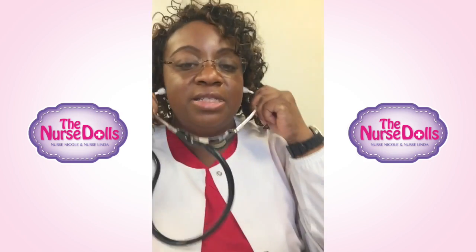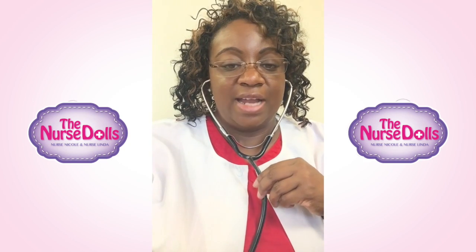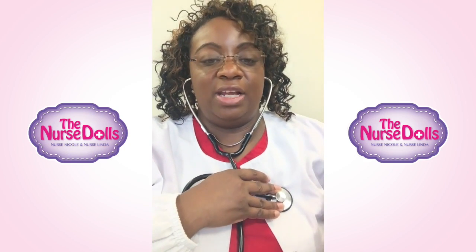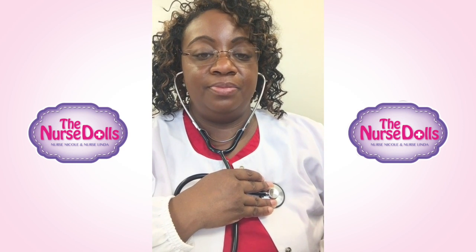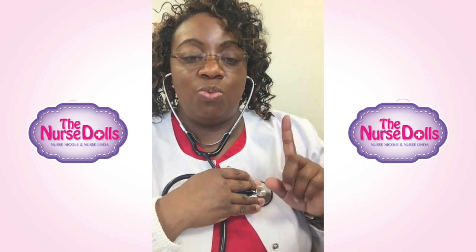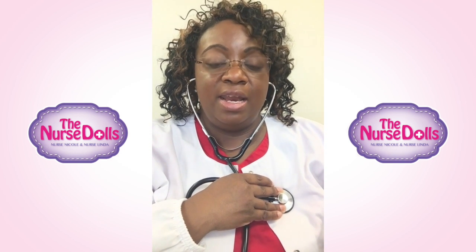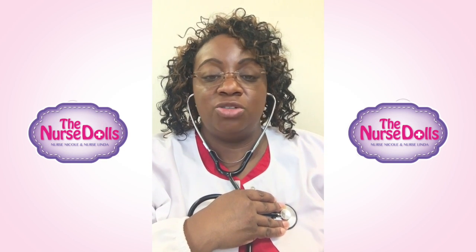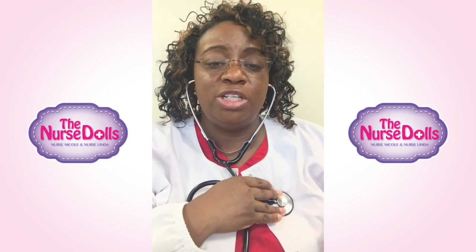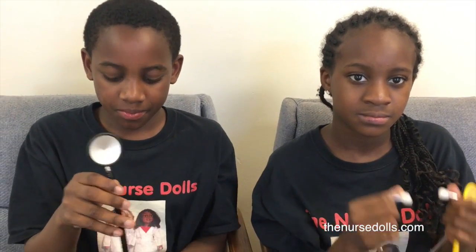Now we're going to take the stethoscope and turn our earpieces in so they fit snug in our ear canals. We're going to put it over the left side of our heart and hear the lub dub lub dub. Each lub dub is one heartbeat. You want to have 60 to 100 heartbeats in a minute — if it's under or over there may be some issues, depending on the age of the person.